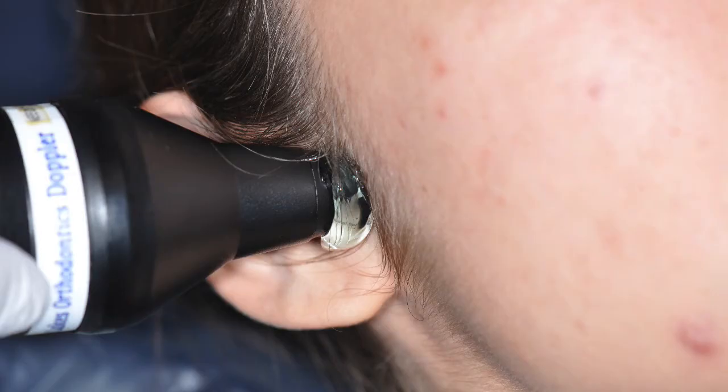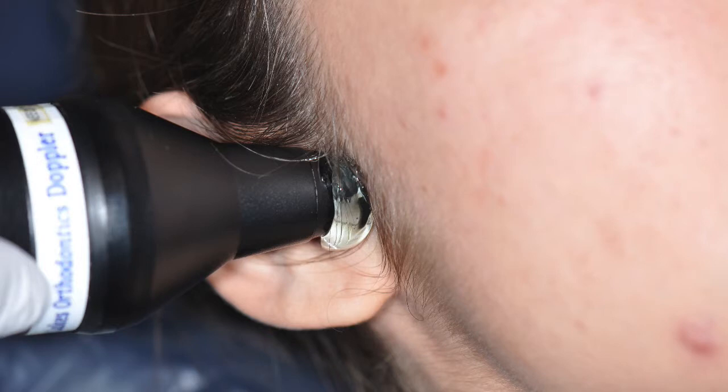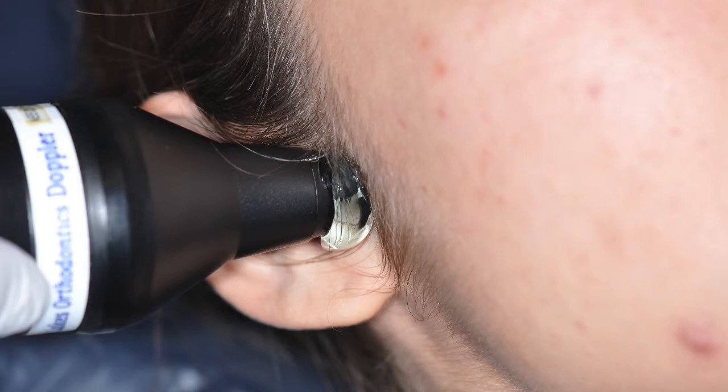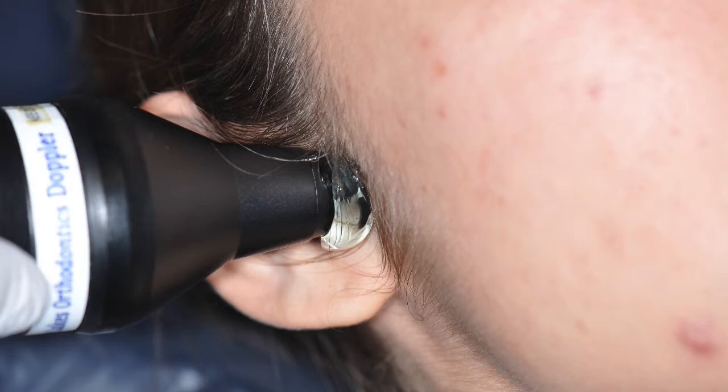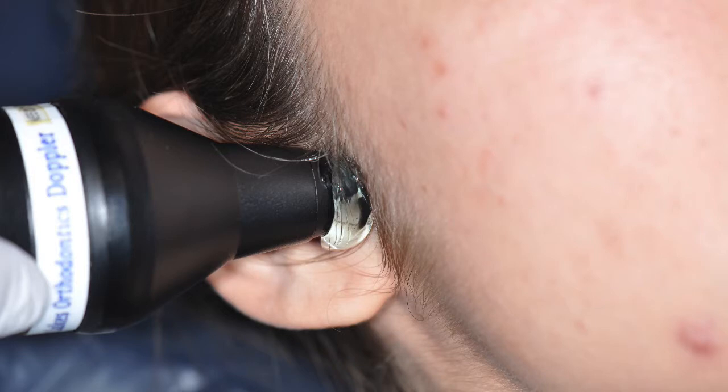Now that you've heard the Doppler video, I want to talk about what was occurring, and then we're going to play it again. Shelly has a lateral pole disc displacement without reduction — meaning she doesn't pop and click. In a joint history, if you asked her she'd say no, but she'd tell you she used to have a pop and a click. If you did palpable joint noises with your fingers over the lateral pole and had her open and close, you would not feel anything — so you might mistakenly think the disc is fully in place anatomically.